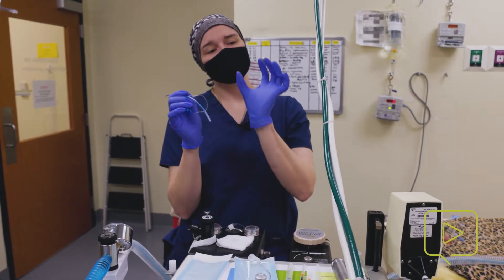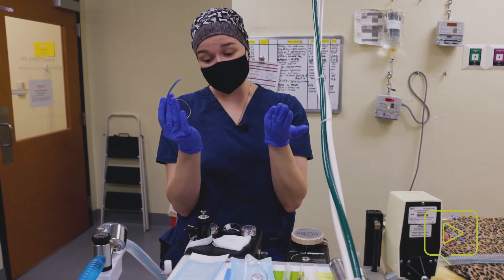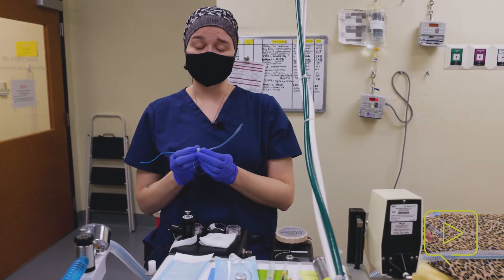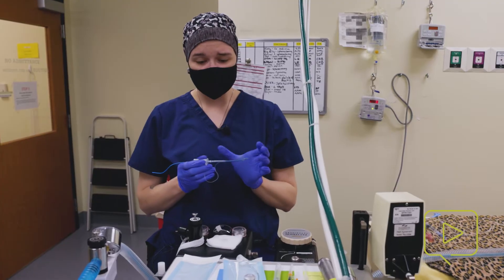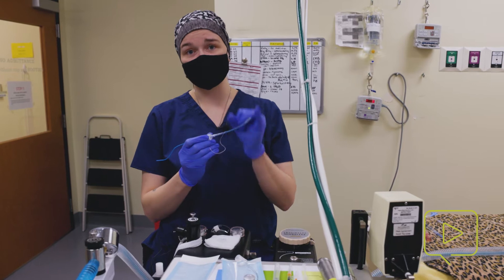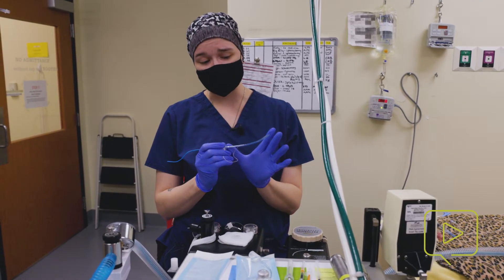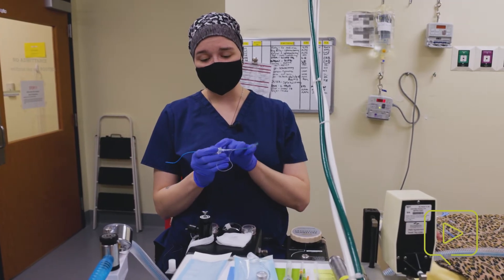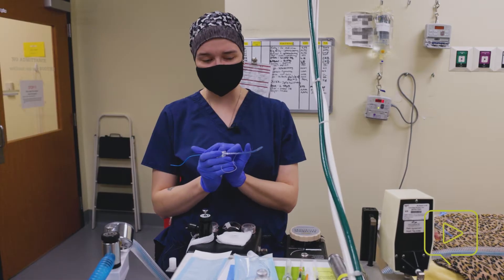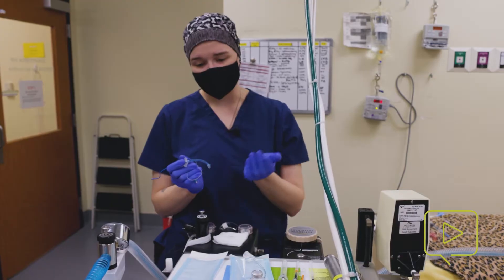When we're placing it, we'll be able to visualize the back of the mouth and have an idea whether this is the correct size we want. Another thing to consider, especially for very small pets and cats, is that a lot of these tubes come much longer. There's a lot of dead space and we want to make it shorter. I've already pre-cut these down to an appropriate size for him using some dog nail trimmers and moving the adapter for the ET tube further down. Dead space just adds to the difficulty of them being able to move gases and breathe appropriately.